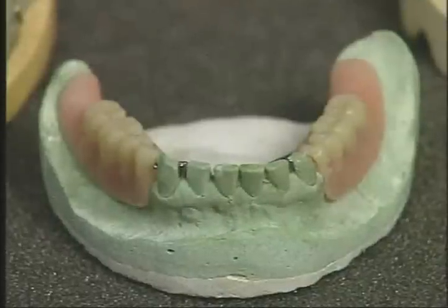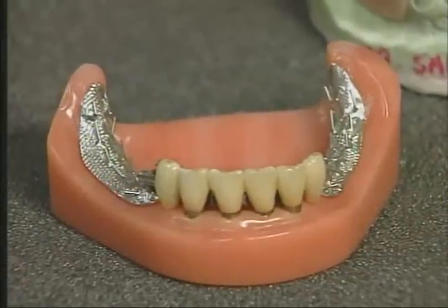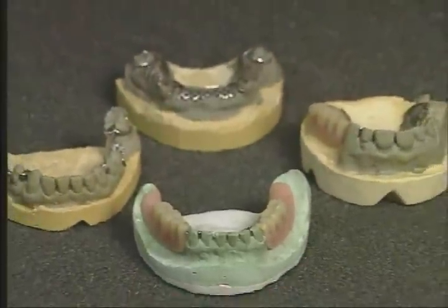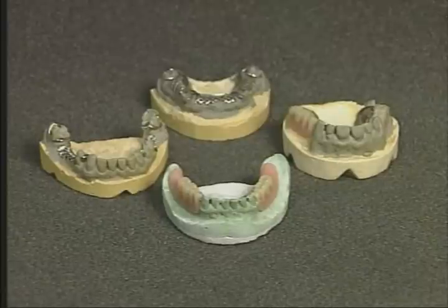The Equipoise removable partial denture system meets all of this criteria and is unlimited in its design applications. The designs work with natural teeth, crowns, and implants, which makes Equipoise the affordable choice for today and in the future. The Equipoise system uses only four basic designs. Dr. Goodman will now show you the four basic designs used in the Equipoise system.